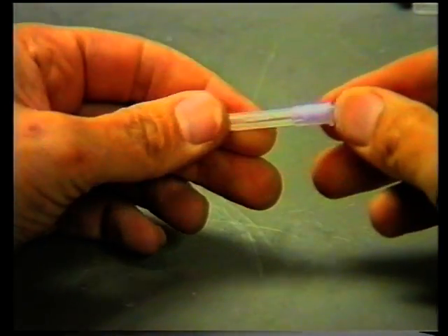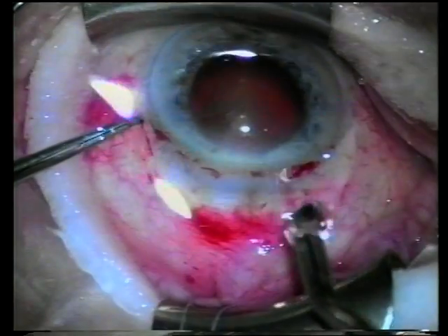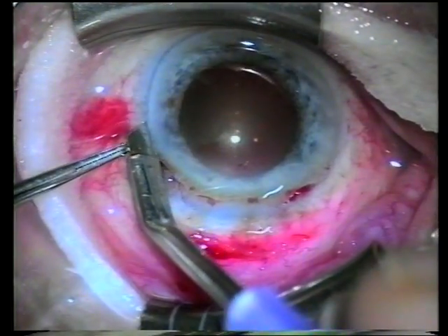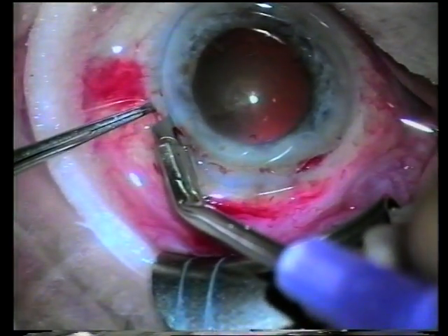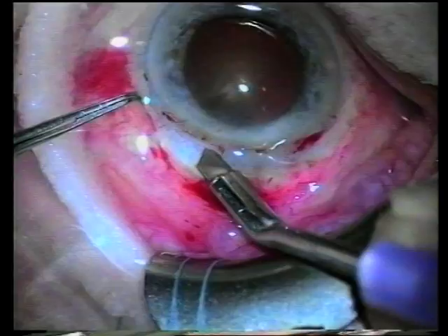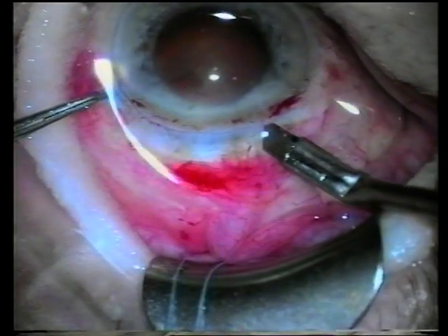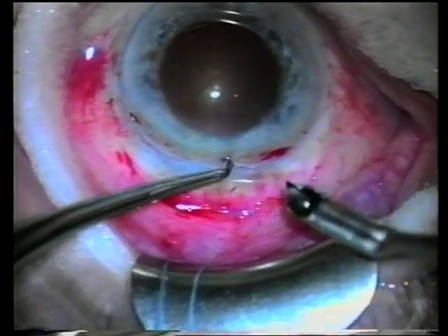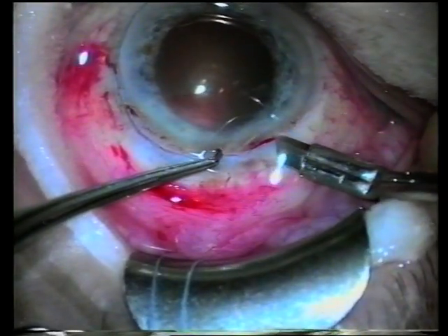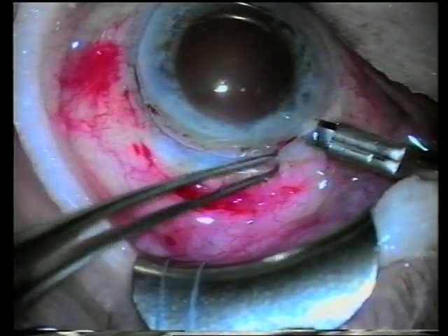Now we have a blade which will do a lovely sharp cut in any ophthalmic surgery — for instance, in intracapsular lens extraction. It will wash the blood away, and at the same time it has a proper fit to enter the eye at a certain depth. This half-depth incision performed here is a standard method for intracapsular lens extraction.